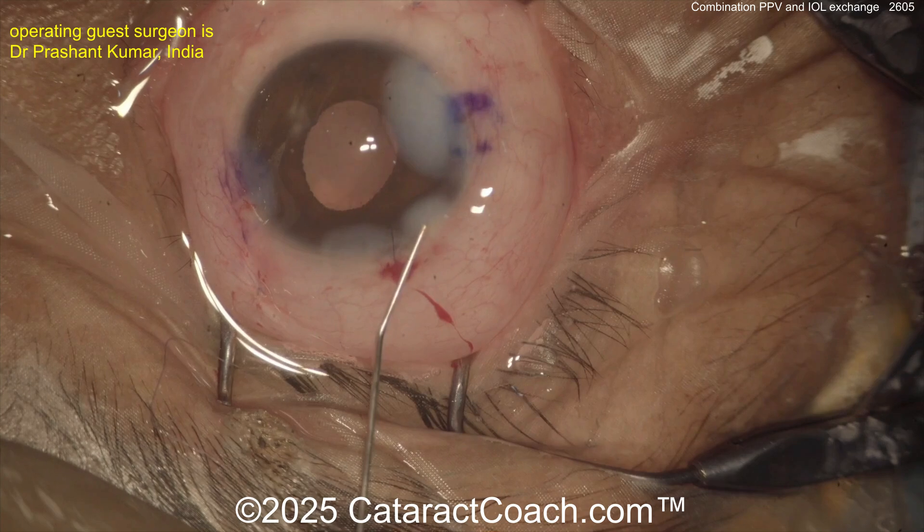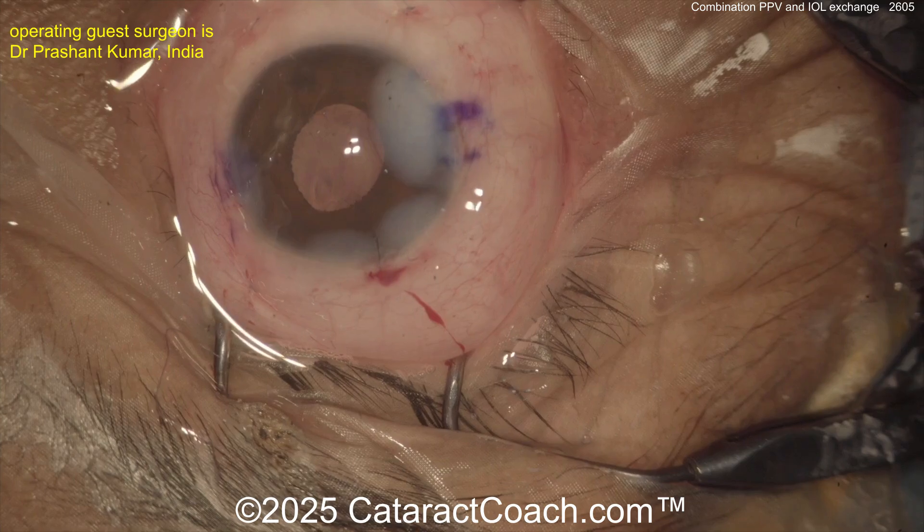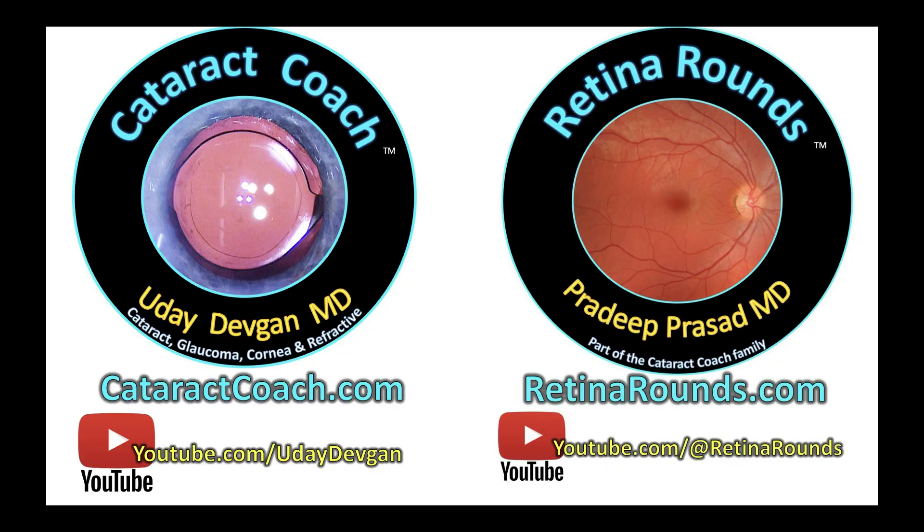The end of the case looks fantastic — I like the suture in the main incision too. Pradeep, thank you and congratulations. Retina Rounds is well past a hundred videos already and still growing — what an amazing channel. If you want to submit your video to CataractCoach, go to our website, and also check out Retina Rounds.